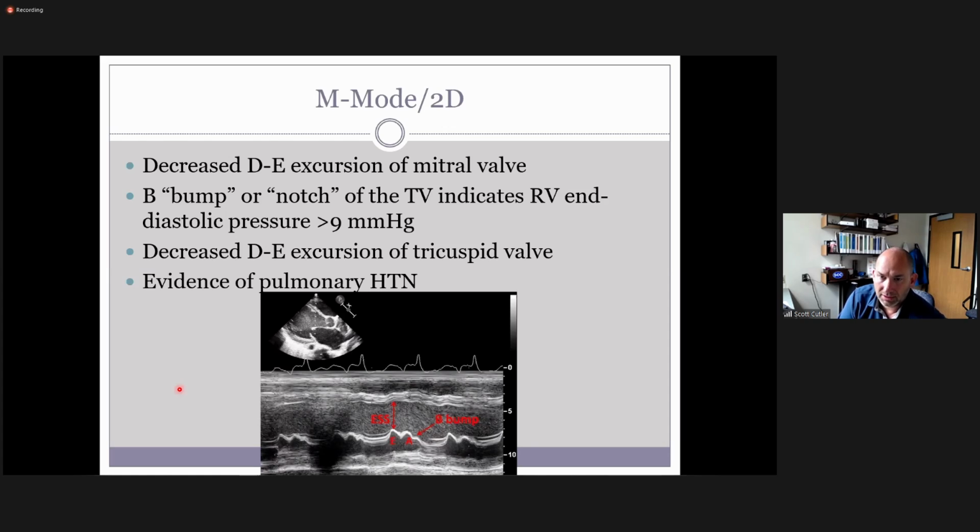That's why we take the tricuspid regurgitant jet. We don't usually take that just to see how bad the jet is. We're actually looking at what the pulmonary pressures are in most cases. And then of course you add the sniff test, the right atrial pressure, to that to give us the RVSP.